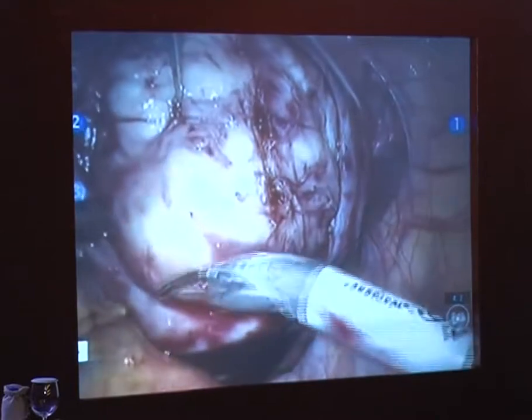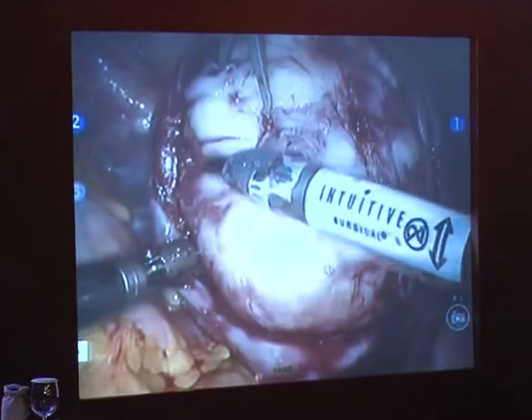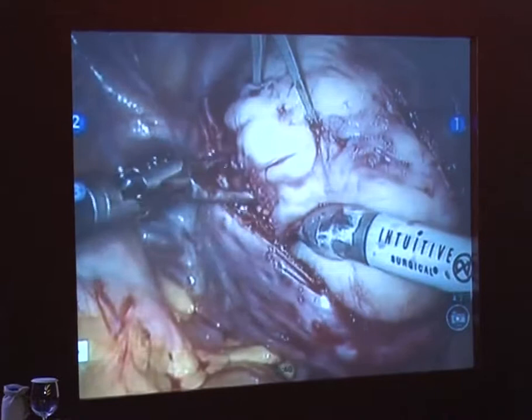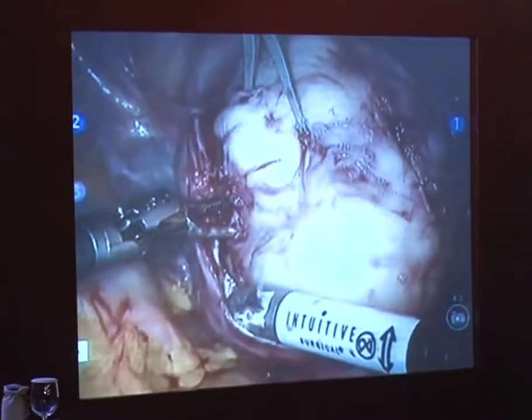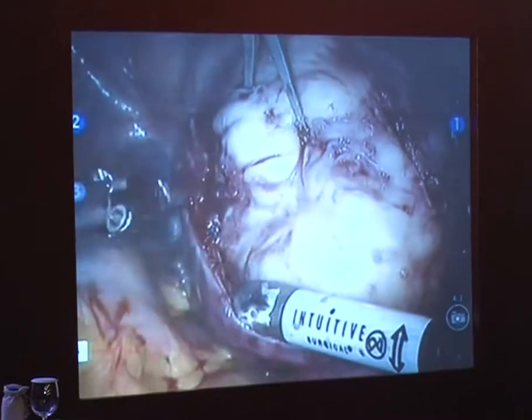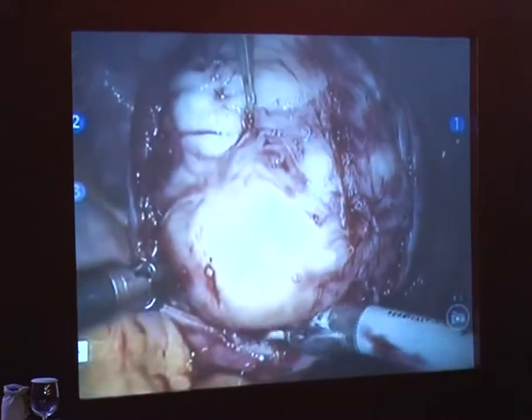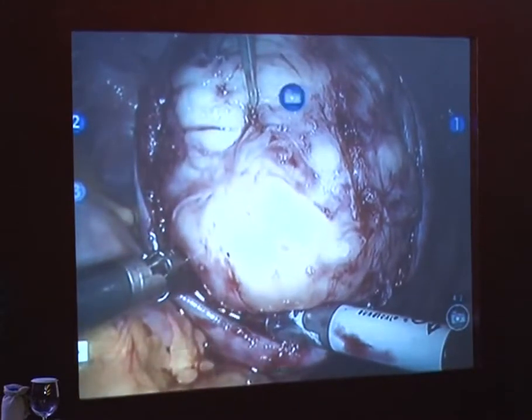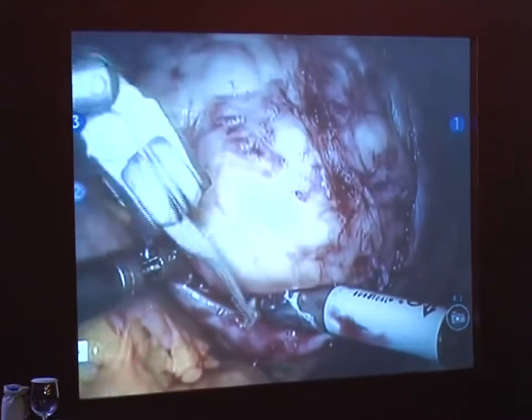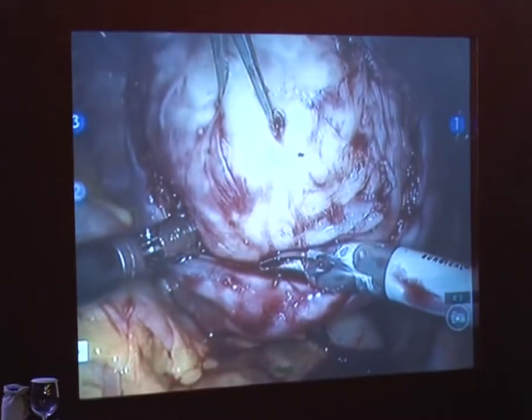Slowly, we're going to just milk this out. You can see it's starting to give, and as it gets to the part where we're almost having enucleated, that's when you really have to tell yourself you don't want to pull too hard. Because what happens when you pull too hard is you get impatient and you rip it out, and then you start chasing yourself, or you inadvertently get into the cavity when you don't really want to get into the cavity. So this is why you have to be very, very careful at this point and have a little bit of patience. When I get towards the bottom like this, I really just take my time. Can you suction in here? Right up in here? Yeah, great.